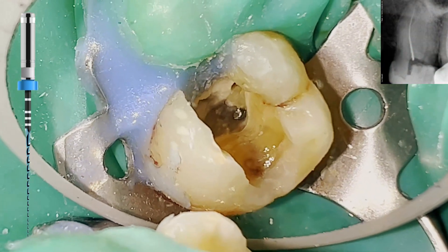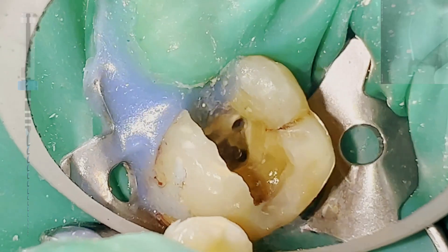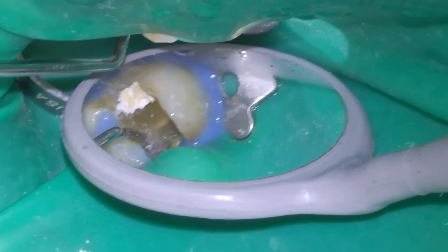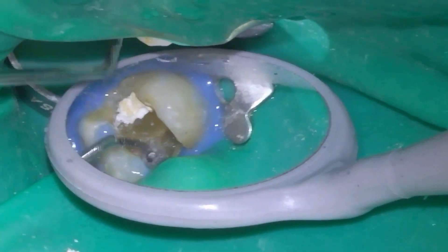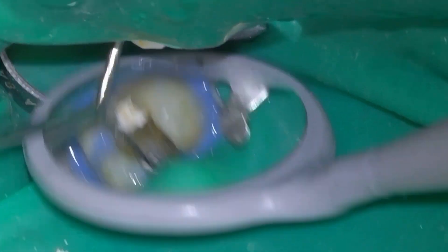The piece of file that has broken is quite long, and we have direct access to it, so the first option is to remove it. The first thing is to make a platform around the file, then with counterclockwise movements we will vibrate the file with ultrasonic tips.